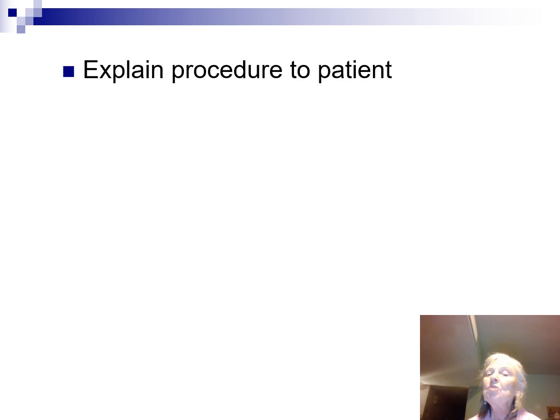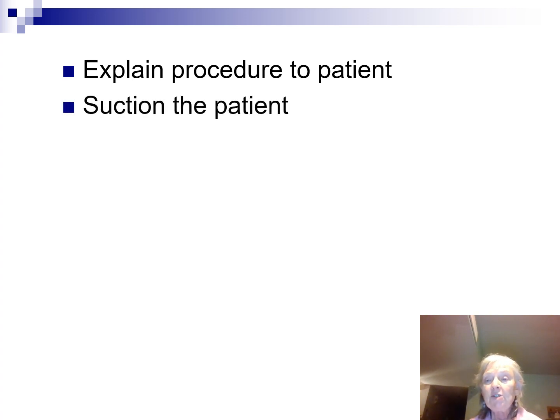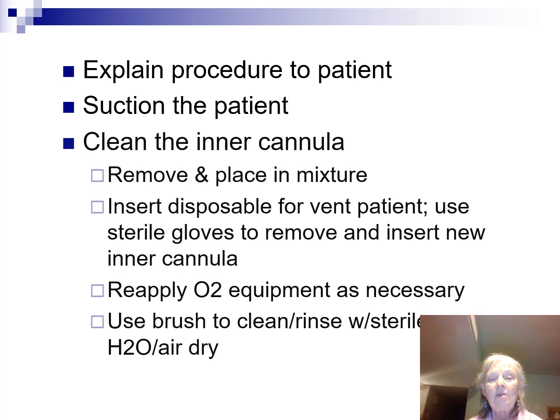You need to tell the patient what you're doing. Sir, ma'am, we're going to go ahead and do your trach care, get it all cleaned up for you. If we need to, we're going to suction that patient. And then what we're going to do is when we have our clean gloves on, we can go and remove that gauze at that particular point.